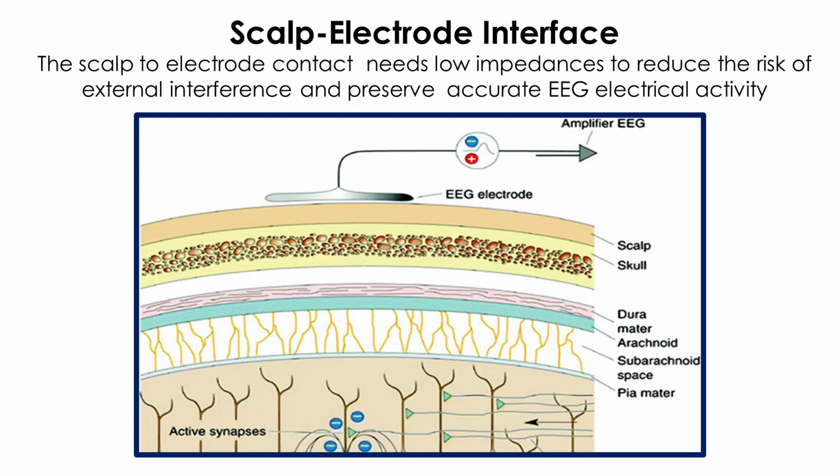What we're trying to pick up is electrical activity that's about 50 times smaller in amplitude than an EKG. You can compare this to listening to someone who's talking in a quiet room versus someone who's whispering in a crowd, and you're responsible for writing down what they're saying. The goal of a scalp electrode interface is to create a quiet environment that seals off electrical noise from other devices in the room and reduces any other artifact that can impact the EEG. Some of the artifacts we cannot control, but as technologists, there are ways that we can reduce the artifact to improve our impedances.